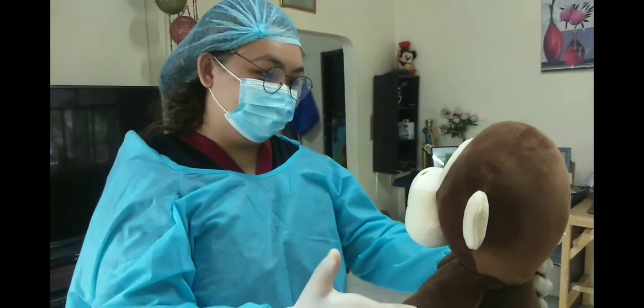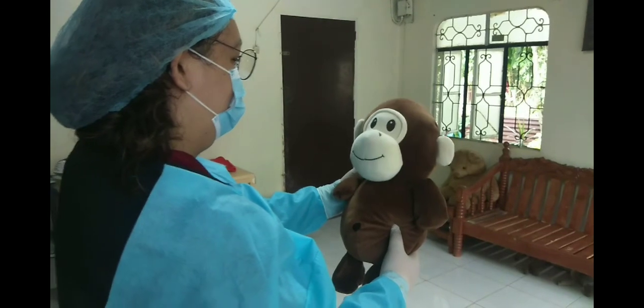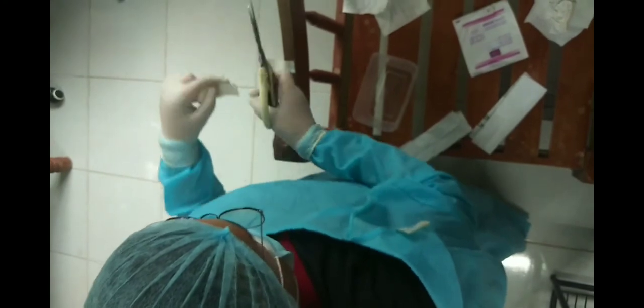When the radiographer receives an order to reapply a dressing, sterile technique must be used. The procedure is as follows. Approach the patient and explain the procedure. Open the sterile towel or drape to double thickness and use it as a sterile field on which to place the sterile dressings. Open the dressings and drop them onto the sterile field without contaminating them. Prepare the tape by having it cut or torn into lengths needed to keep the new dressing in place. Place tape in a convenient place away from the sterile field.